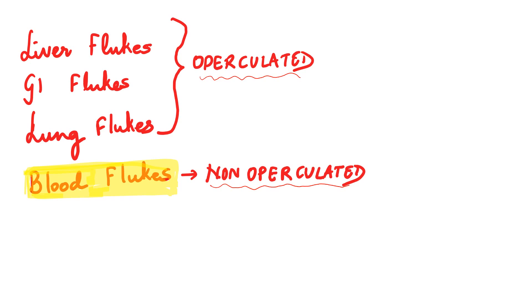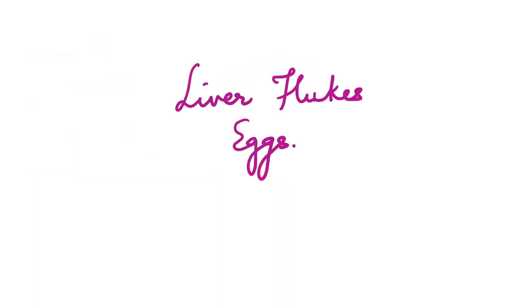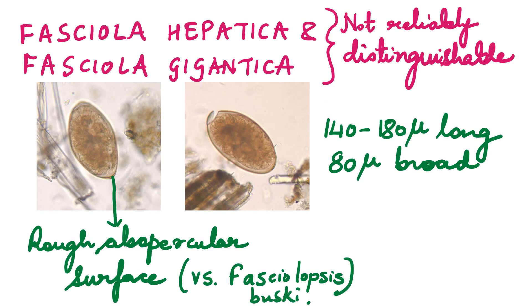Let's start with the liver flukes. Liver flukes belong to the following genera and species: Fasciola hepatica, Fasciola gigantica, Clonorchis sinensis, Opisthorchis viverreni and Opisthorchis felineus. Amongst them, Fasciola species — Fasciola hepatica and Fasciola gigantica — the eggs passed out in the stool cannot be reliably distinguished from each other. They almost look the same.